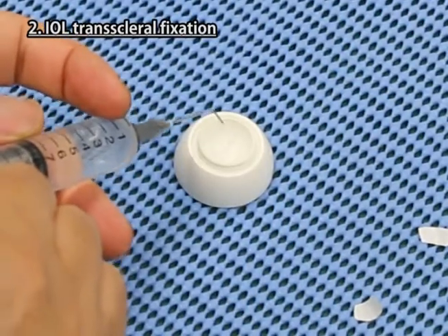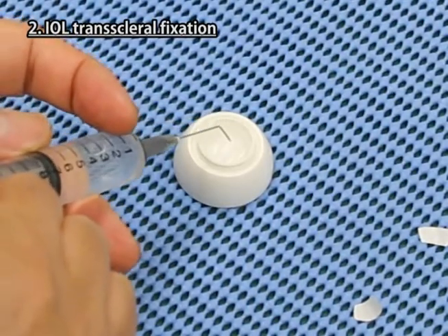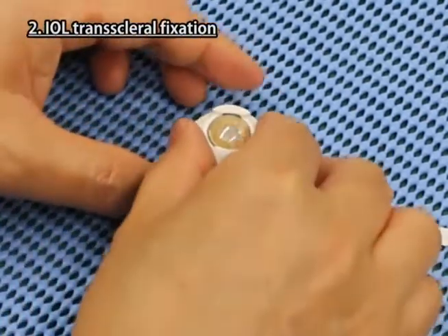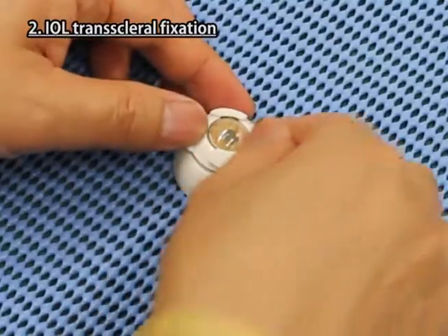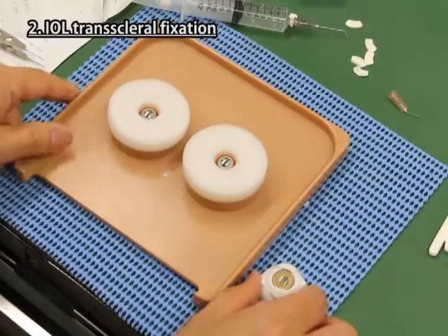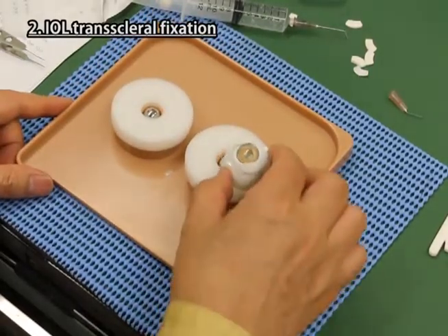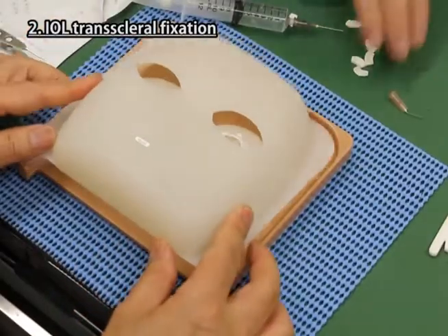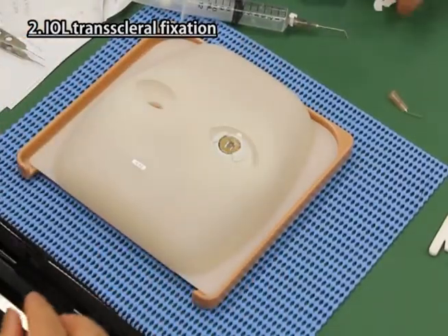Fill the hollow of the scleral part with water or viscoelastic. Fix the cornea iris part with scleral sheets firmly onto the scleral part. Place the sponge on the iron ball of the right side; the left side is the deep-set eye position. Set the eyeball part onto the base plate and cover it with the mask.